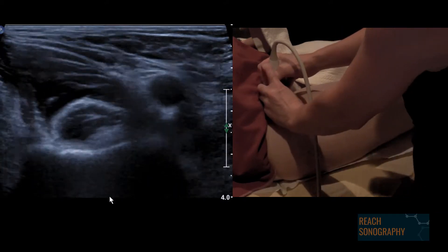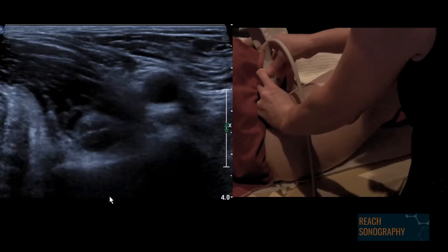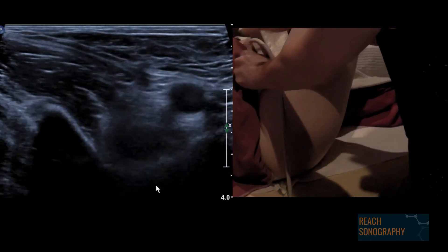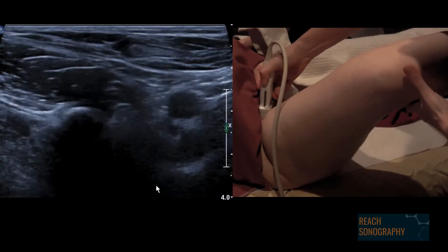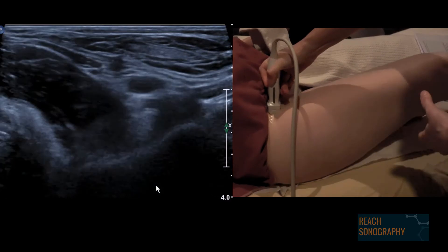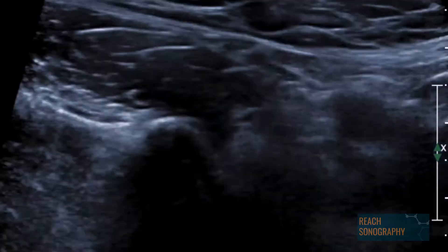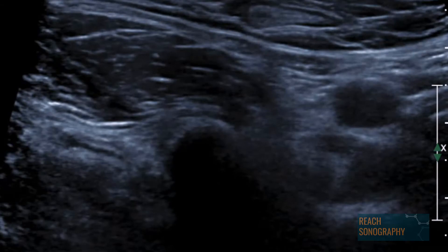My left hand is guiding, my right hand is putting the pressure. Bring your knee up to flexion — you can see our tendon has popped right up off the bone. Now bring it out to the side and just hover; it doesn't matter if you lose it momentarily. I've swapped my grip to the inside. Do one smooth movement, up to the hip like a breaststroke kick — you can feel that under the transducer. We'll wind it back so you can see it, trim that, and play that little video. Nice example.